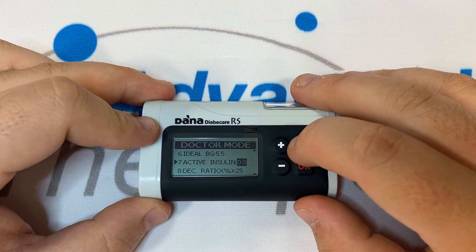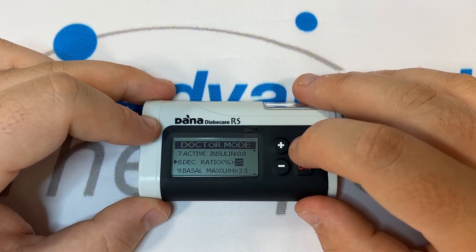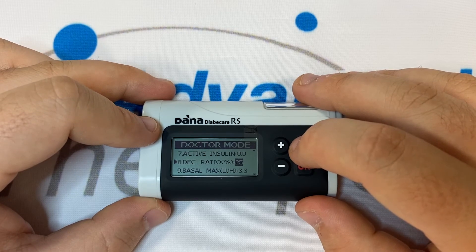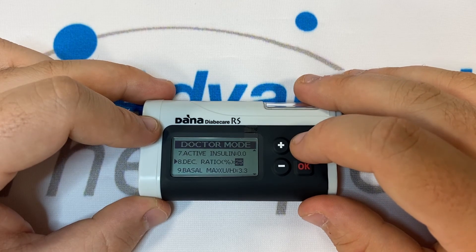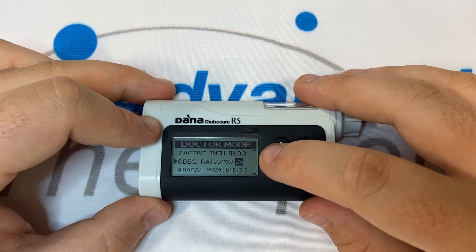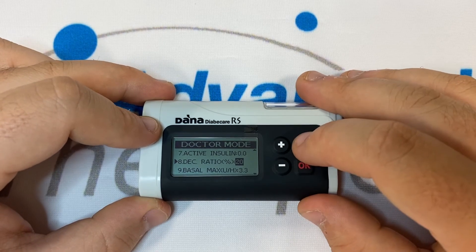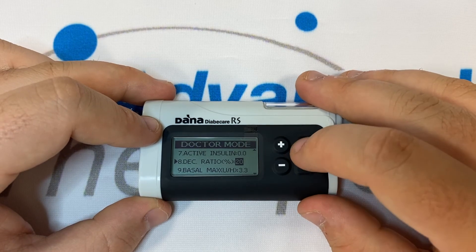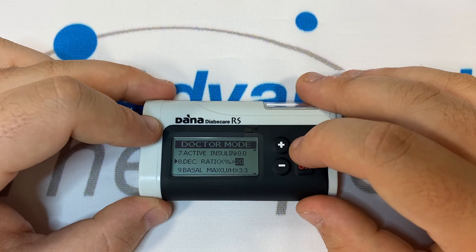Number eight is Deck Ratio — this stands for Decreasing Ratio and is how we express duration of action. A 25 deck ratio is equal to a four-hour duration of action, as 25% of your insulin is used each hour until 100% has gone. A 20 deck ratio would be equal to a five-hour duration of action, as 20% of your bolus insulin is used each hour until after five hours 100% has gone.